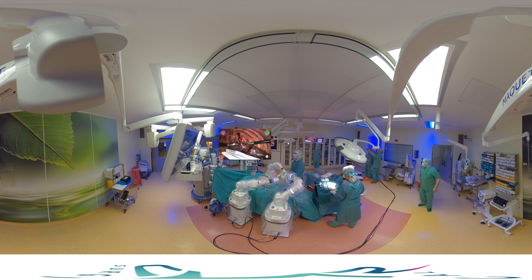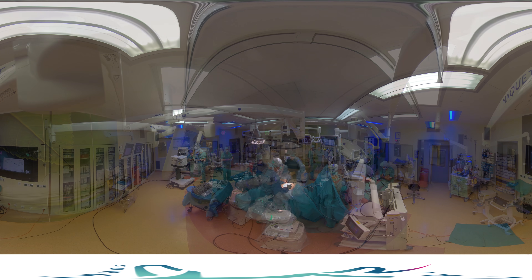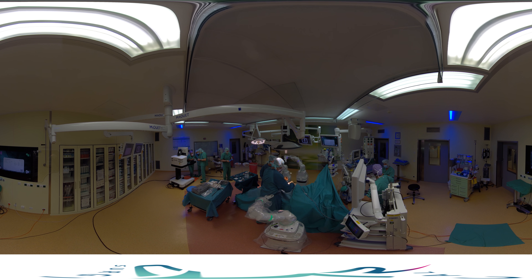The specimen is taken out by using a plastic bag. After finishing the operation, the skin is now closed. Thank you very much for watching this video, and goodbye.